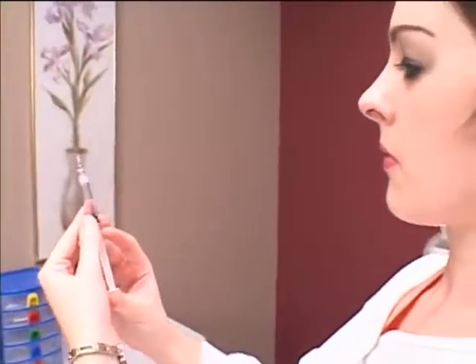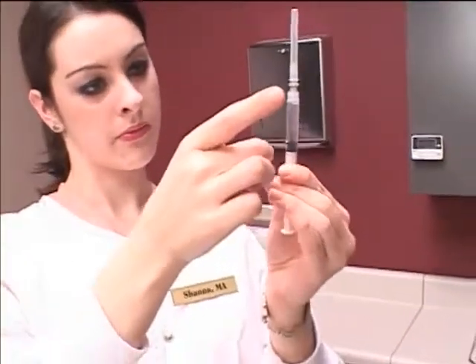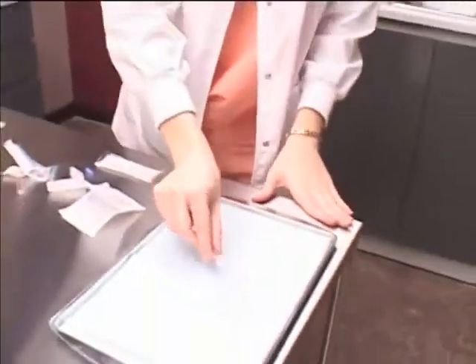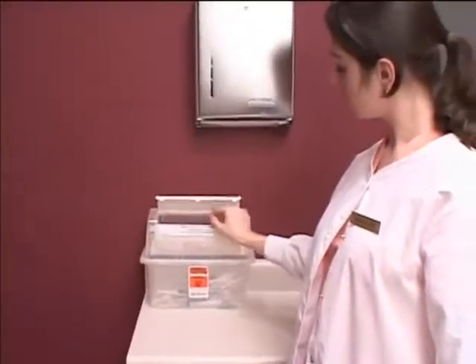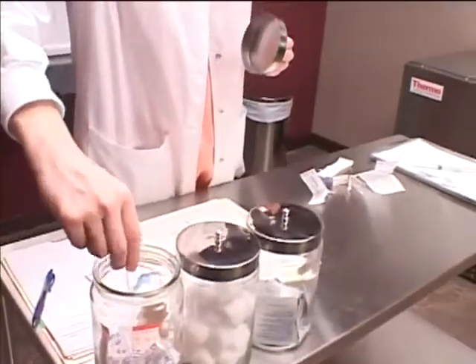Push the medication to the top of the syringe and place the cap on the filter needle and flick away any air bubbles. Remove the filter needle and replace it with the capped injection needle and place it on the medication tray. To prevent documentation and medication errors, check the ampule against the physician's order, then dispose of the ampule in the sharps container. Set up a cotton ball, alcohol pad, and adhesive bandage.